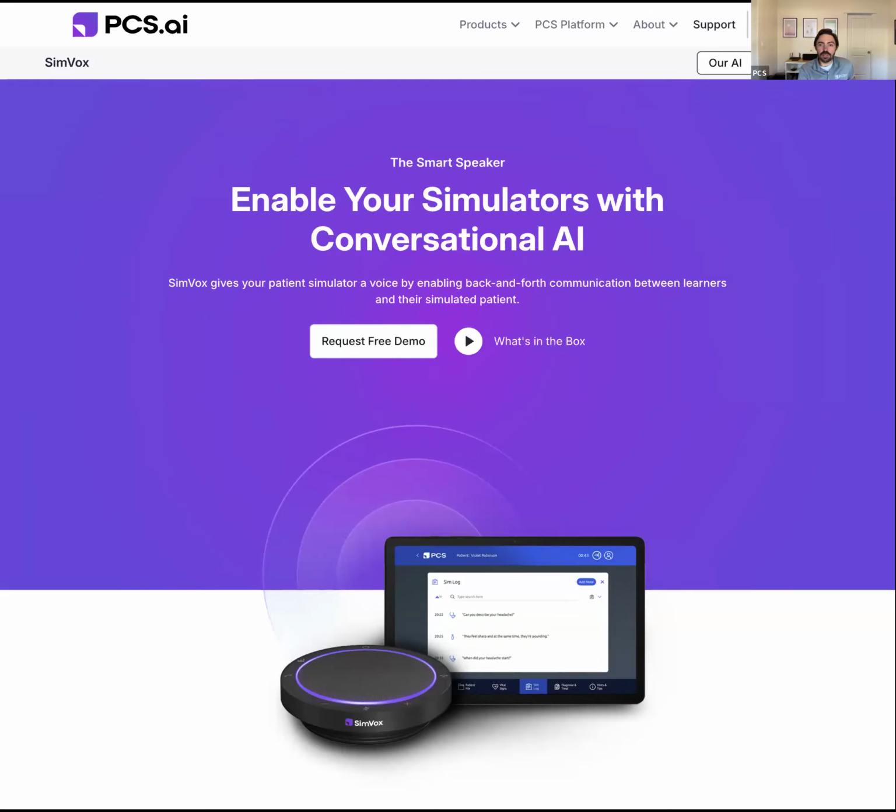So you're not necessarily limited by what we provide. You can use the scenarios that you're already running on your mannequins and incorporate them into SimVox, and have SimVox play the voice of those scenarios as well. We're going to jump into a live demonstration in just a little bit, and I'll showcase how that functionality works to create your own custom scenarios.